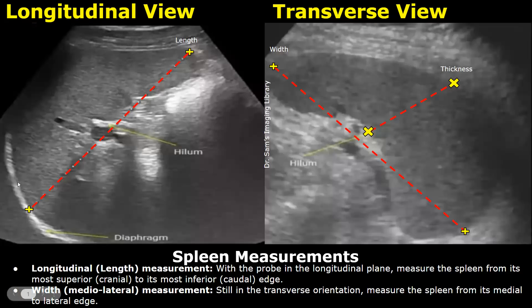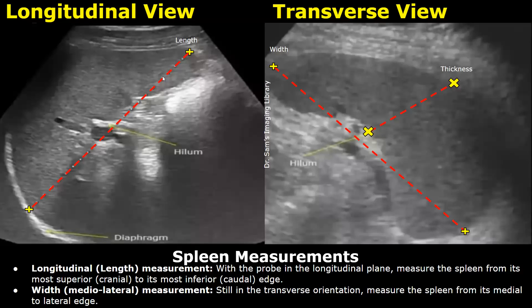Place the second caliper at its inferior edge in this manner, and you will obtain the splenic length. This is its craniocaudal measurement.